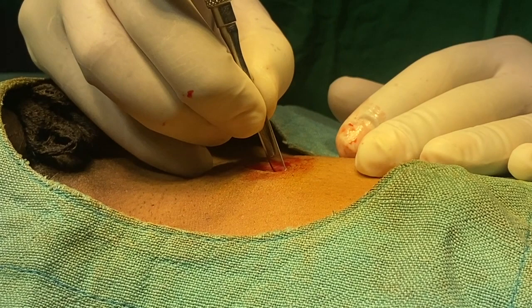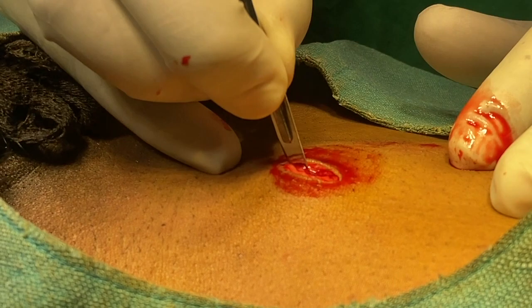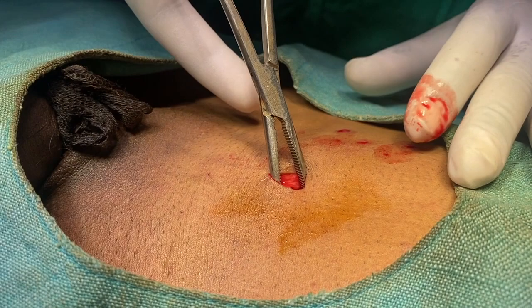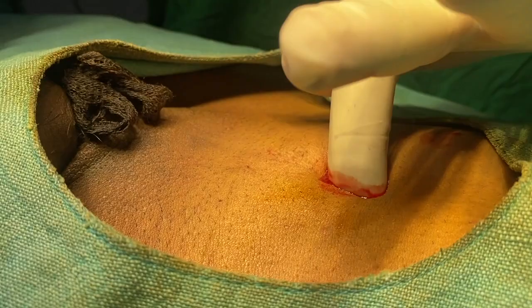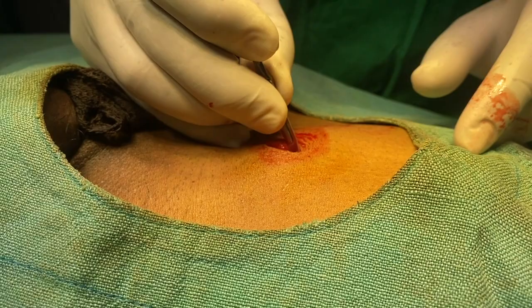The sound of cutting the rectus sheath is a grating sound — you can hear it. We also get a feeling that we are cutting something. With the hemostat we confirm that we have cut the rectus sheath adequately — we should be able to see the muscle. I am not fully satisfied with the incision, so I will cut it a little more. With the finger I can palpate that I have adequately opened the rectus sheath.